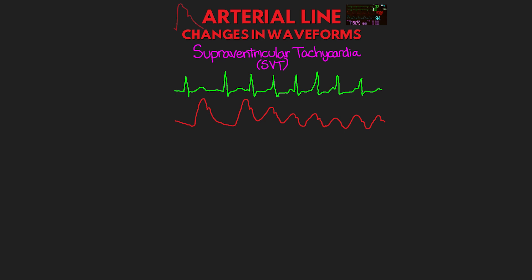The next arrhythmia is supraventricular tachycardia or SVT. With SVT, we're going to see a similar phenomenon as we do with AFib. The rate will often be relatively stable with less fluctuation, but we will see a reduction in cardiac output as that rate increases, leading to a decrease in systolic upstroke and peak systolic pressure in our waveform. We typically can see sustained, very fast rates with SVT, and thus can really see a reduction in our patient's blood pressure manifested by the diminished waveforms. In the example here, you can see that the patient enters an SVT rhythm, and we see a noticeable drop in the pressure tracing that declines further as it gets faster.